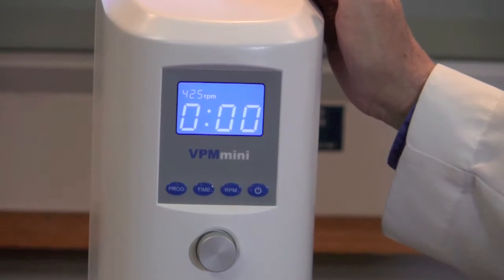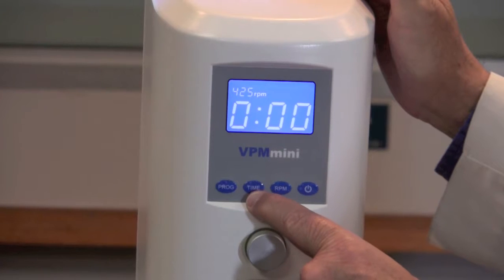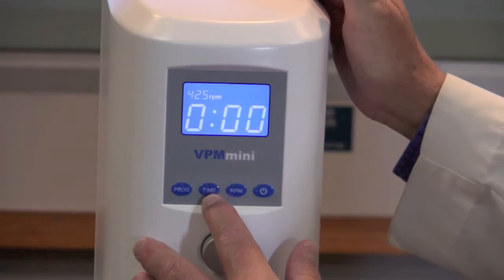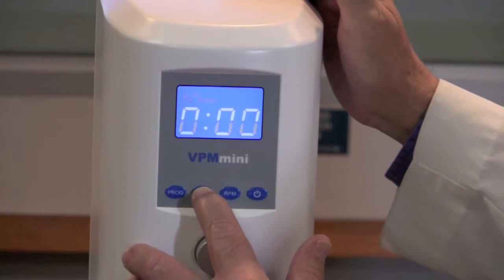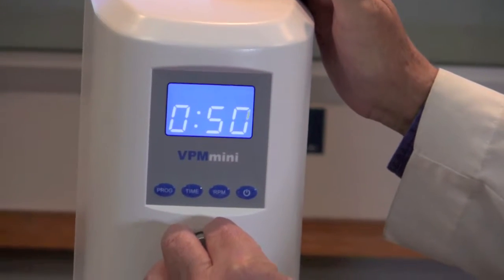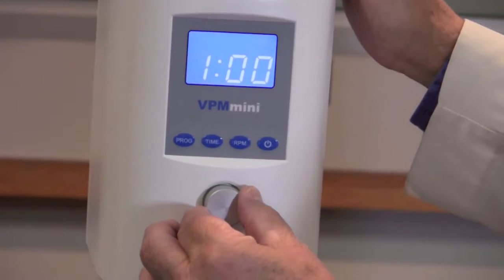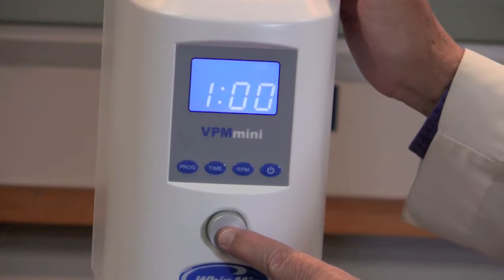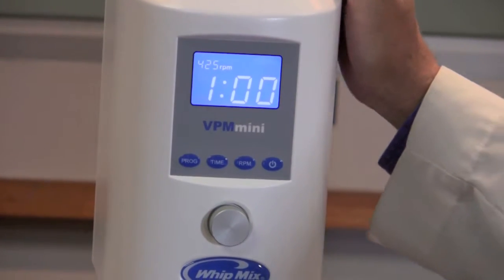Now once you've done that, we're going to select the amount of time that this particular program is going to run. Press the time button and select the amount of time you would like your program to run. Once you've done that, press the silver button again and you've programmed your program.